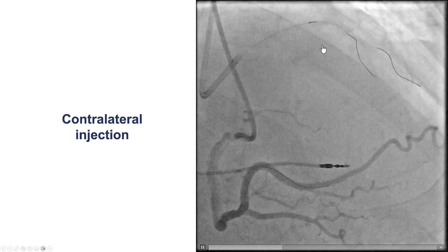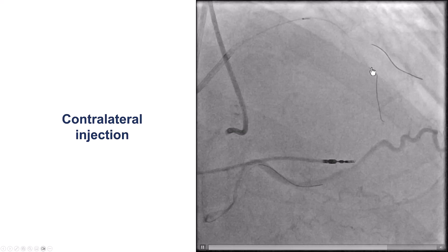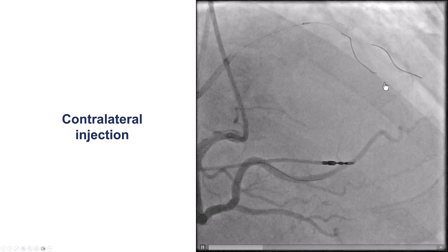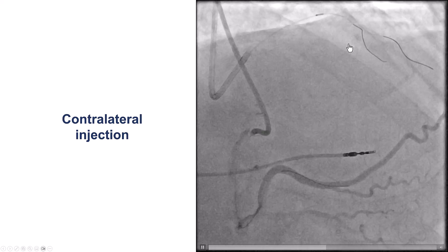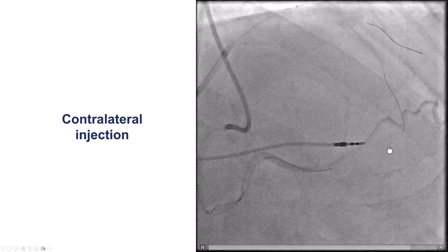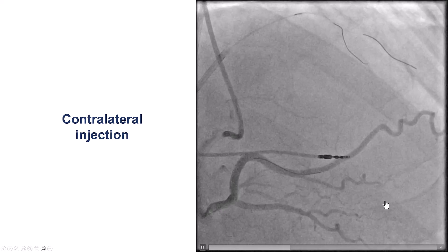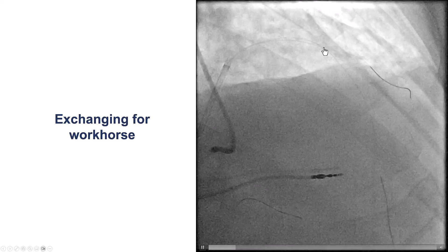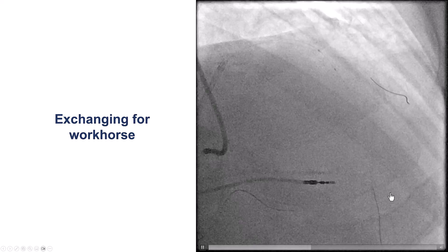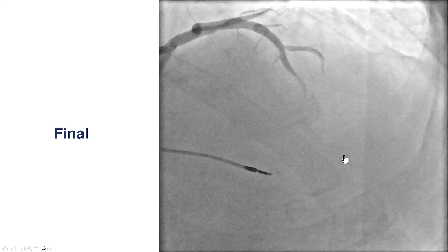Like every CTO, once we think we are through, the next step is a contralateral injection to confirm position. In this case, visualization is poor, but we advance the guide wire and it goes easily, coursing along the vessel — an important tip to confirm the wire is tracking within the target vessel. The next step is to get a single-lumen or dual-lumen microcatheter and exchange this wire for a workhorse wire, which is what was done.